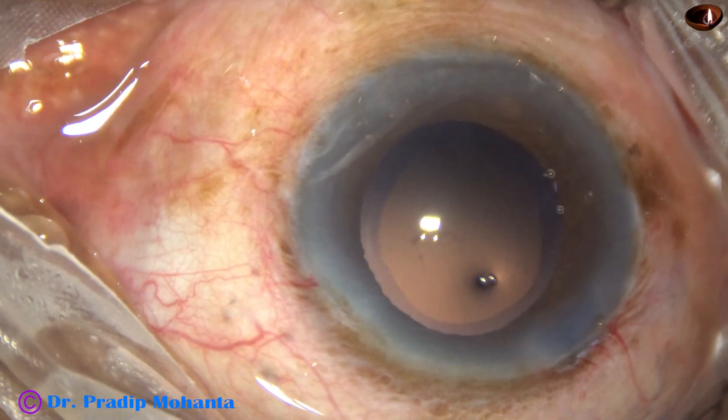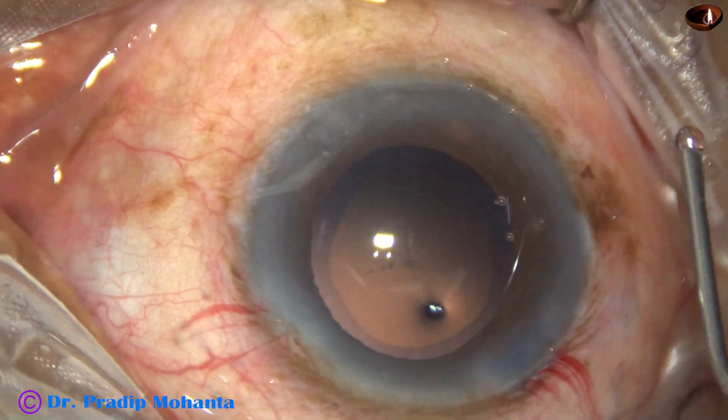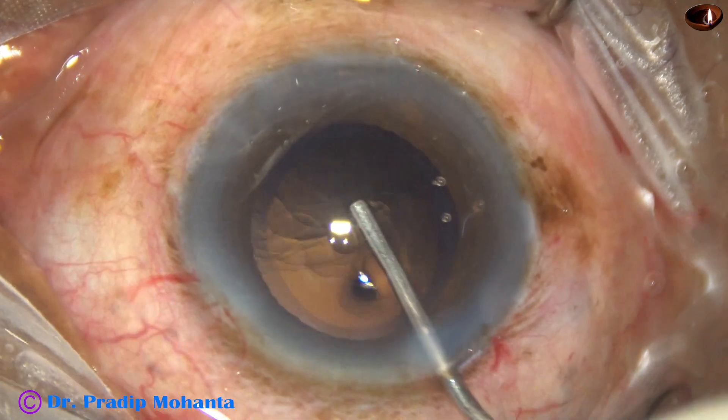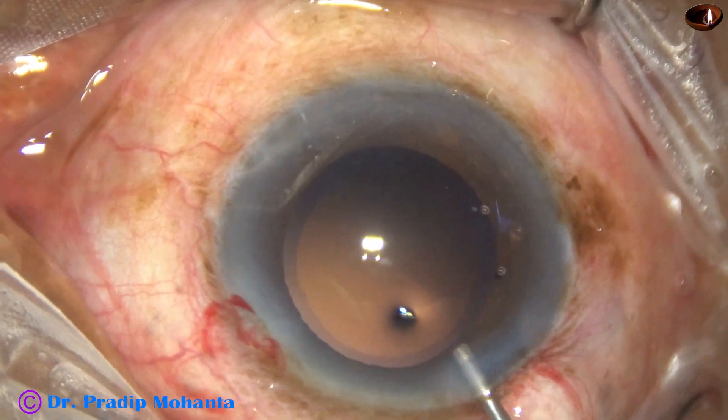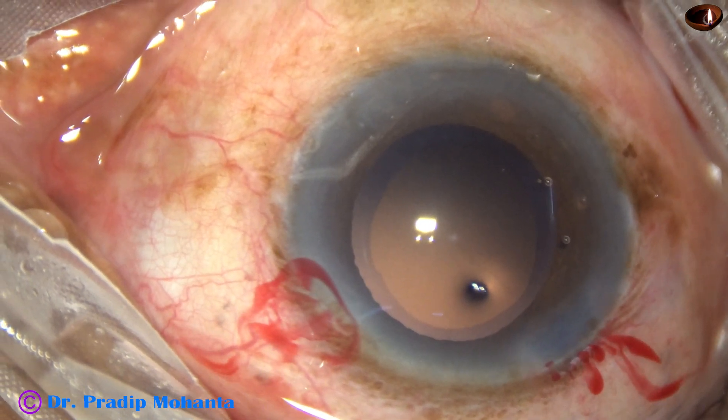And now, I am going to use visco for implantation of the intraocular lens. Fill up the capsular bag as well as the anterior chamber with visco. And now, let us see the lens.